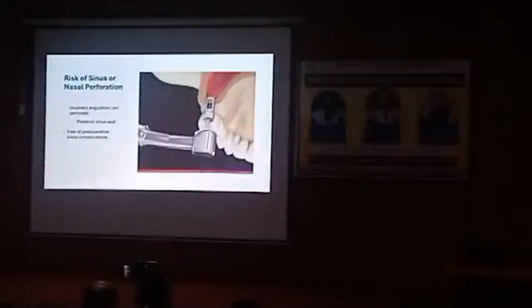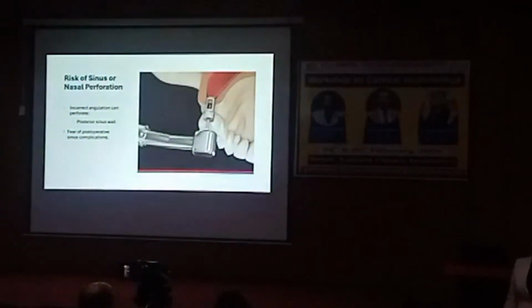Studies say, you can search on all the search kits, wherever you want, you just type on Google how much perforation of the sinus membrane can heal on its own. Up to 5 mm of perforation into the sinus membrane can heal on its own. And when we are drilling, we are using only a 2 mm drill, and the tip of the drill is 0.6 mm only, the pilot drill that we are using. So if you perforate the sinus while drilling, no issues, it will heal on its own.